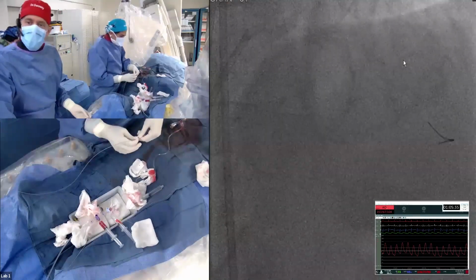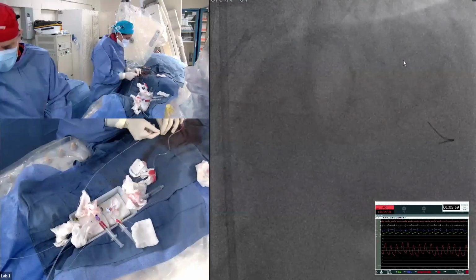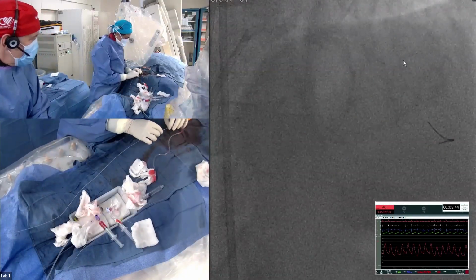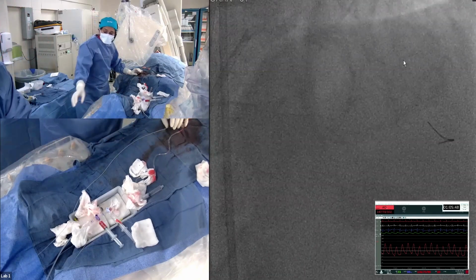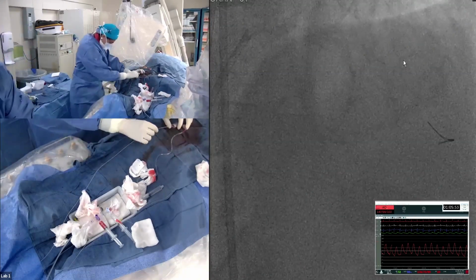Yeah, I was going to ask what your next steps are. It's important to know what balloons you're going to use, and what's your next step after that? It's very hard to dilate calcified nodules, and you really need to know that. So I was telling you it's not going to be easy to expand the stent. This is the area where stents are coming back.